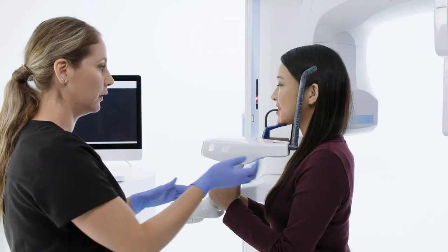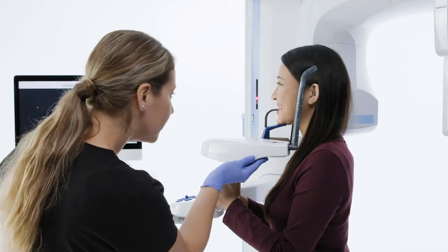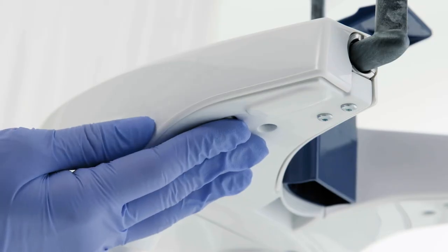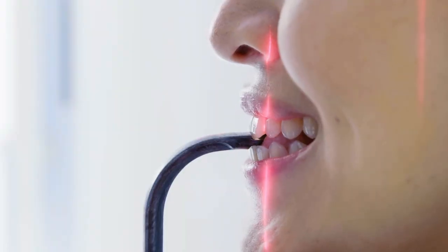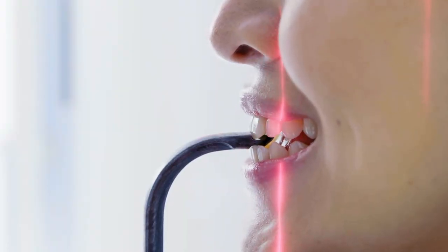While standing to the left of the patient, roll the thumb wheel to position the layer light in the interproximal space between the cuspid and the lateral incisor. The layer light represents the middle of the focal trough.